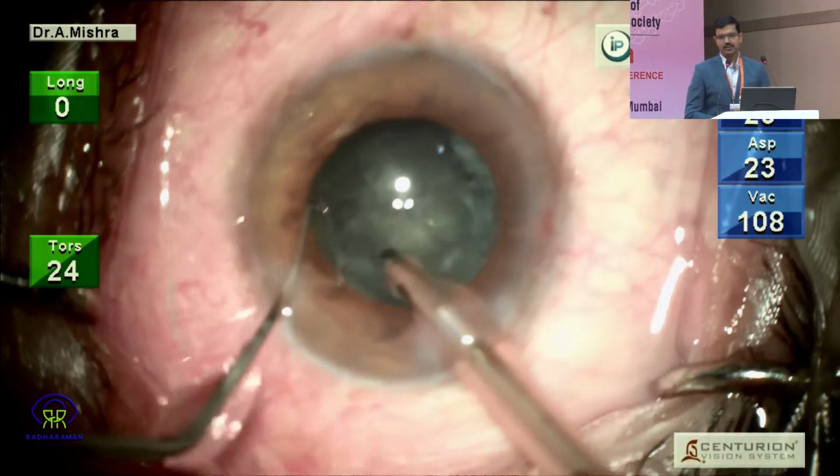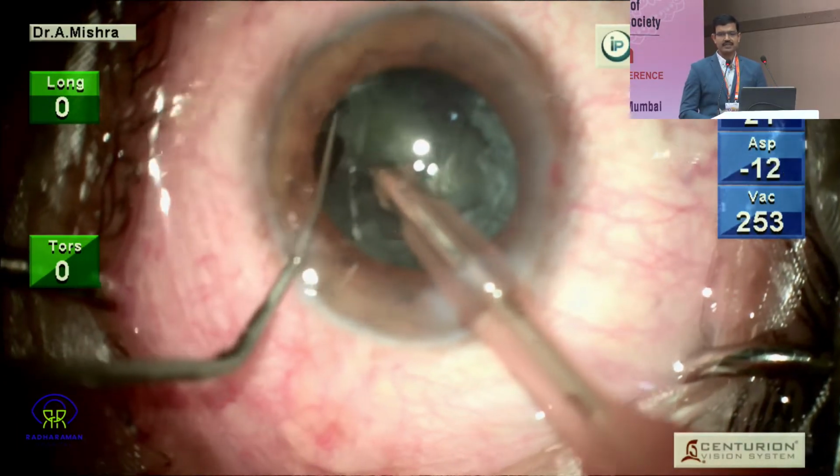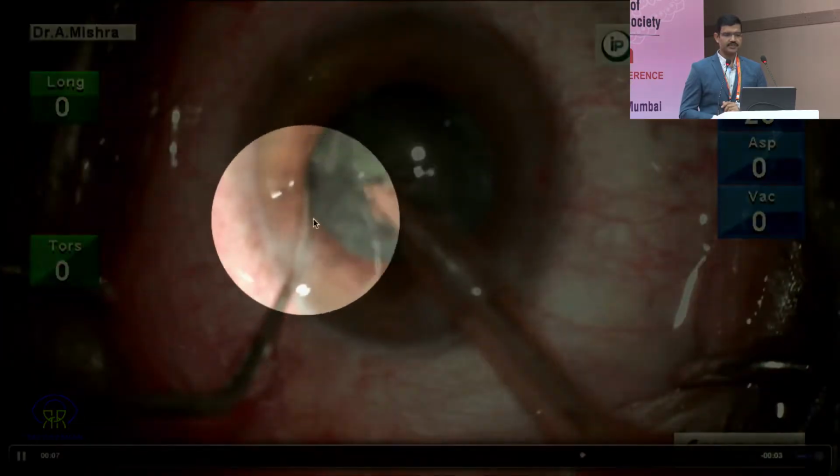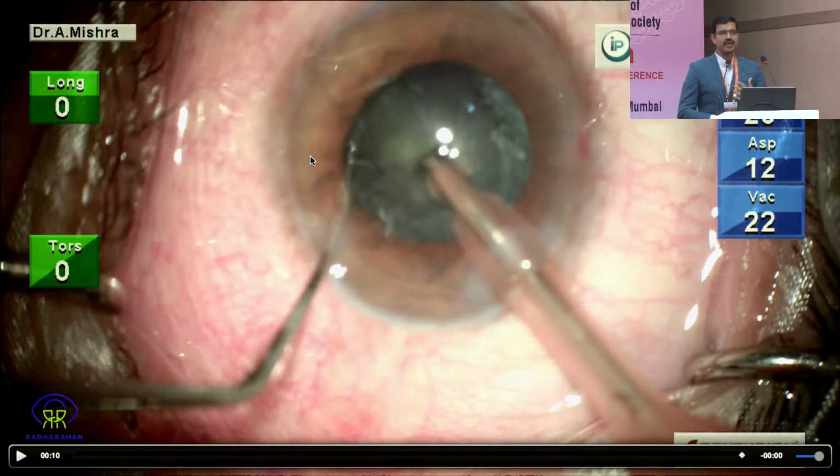One of these things is to see the hole happening. So there's one learning point here. Look at this hole happening in the periphery. So the first learning comes right here: never ever take the phaco needle too peripheral. It does go peripheral when the cataract is soft, but we have to find a way in which we remain at the center. So just go down on your power, learn to control your foot switch, chop more with vacuum, less with power. That's the trick to do it.